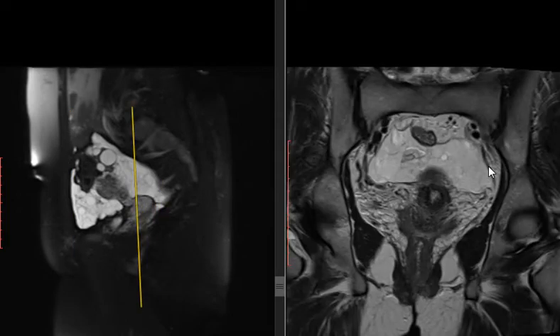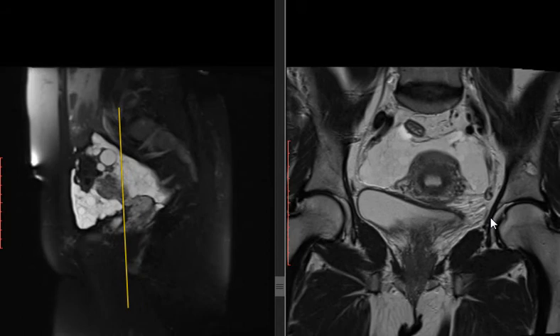Well, it's peritoneal in origin. Yes, I said peritoneum. She said peritoneal. I didn't know. But okay, I said something arising from the peritoneum. Good. It's peritoneal in origin. It's benign. So I gave you two clues: benign, from the peritoneum.